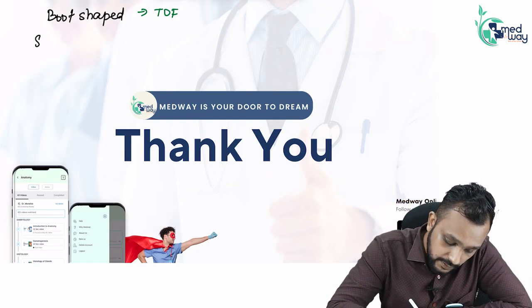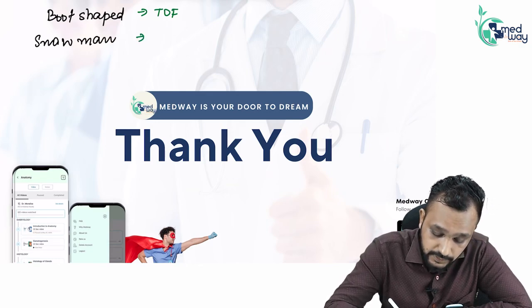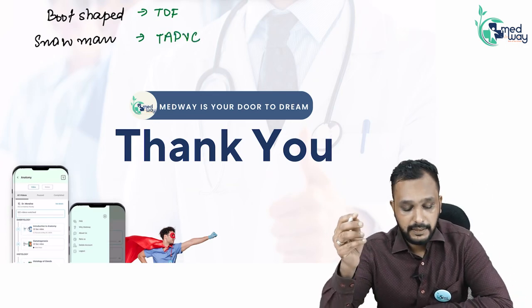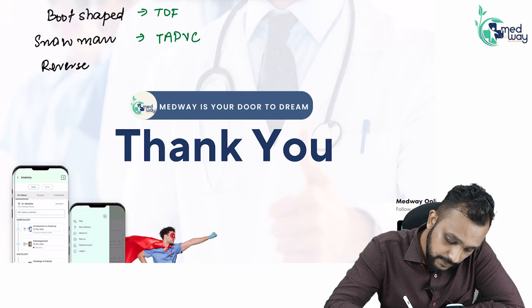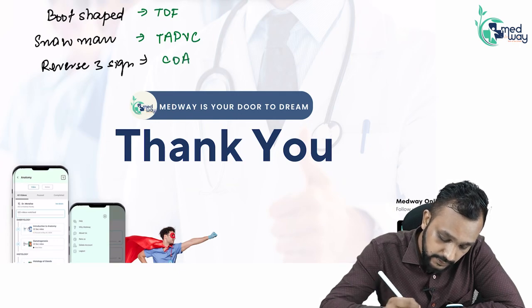Then you have the snowman appearance. This is seen in patients with total anomalous pulmonary venous connection. Then you have the reverse 3 sign seen in patients with coarctation of aorta.